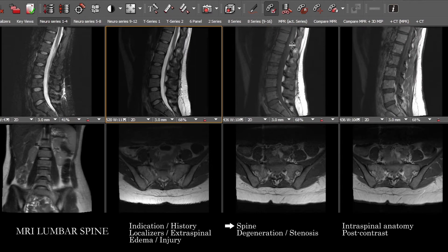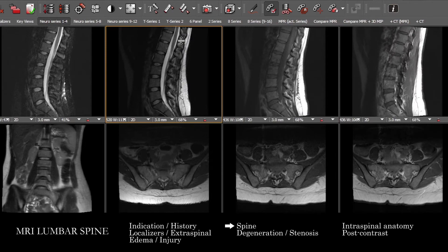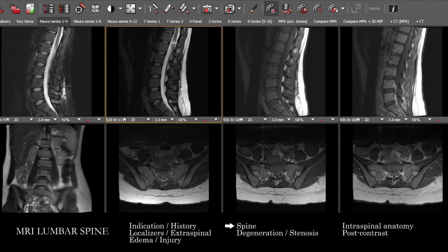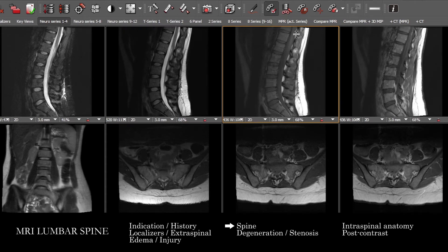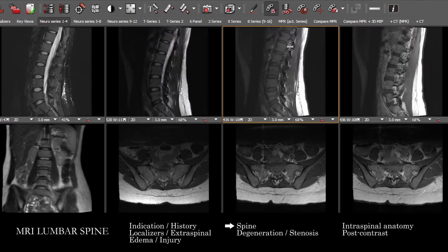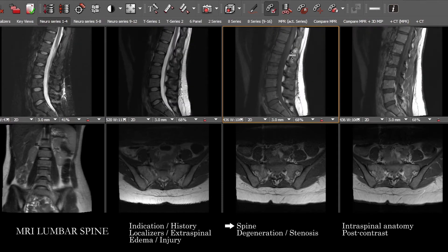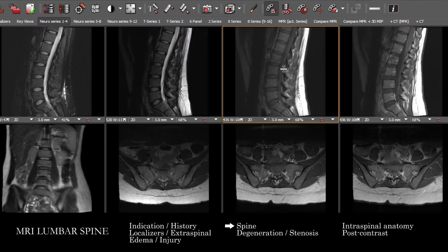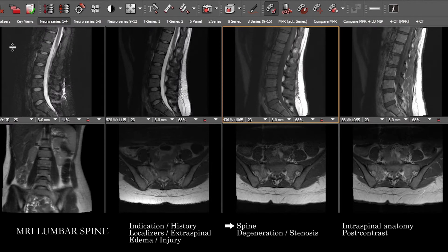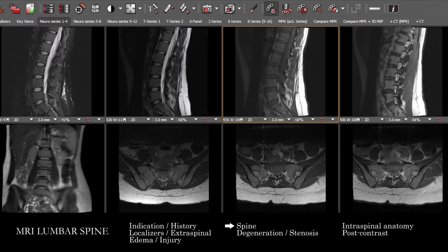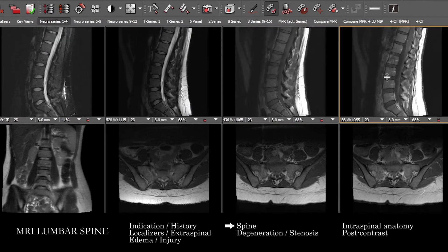Typically I look for any suspicious abnormal marrow replacement on the T1 pre-contrast — typically darker than muscle or disc, though I prefer to use muscle for comparison because disc signal can change with pathology. Compare marrow to muscle, look for abnormal marrow replacement, compare that to marrow edema, and if there's anything abnormal, look for abnormal contrast enhancement.